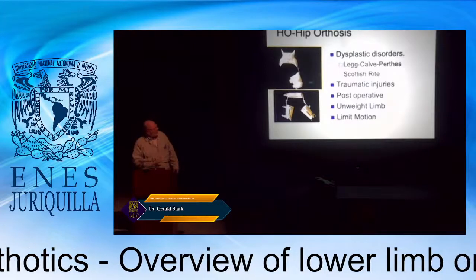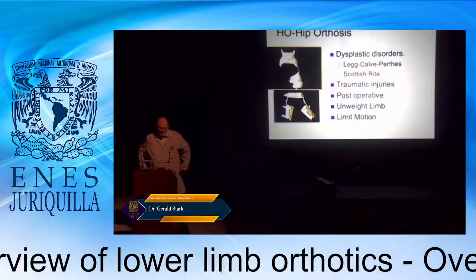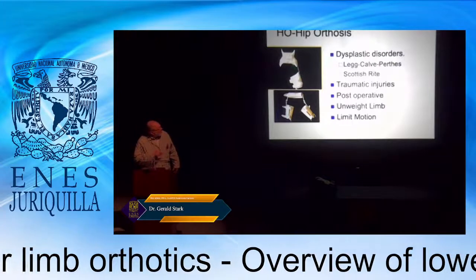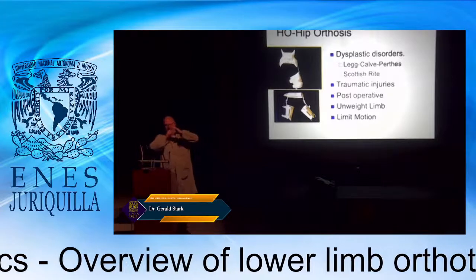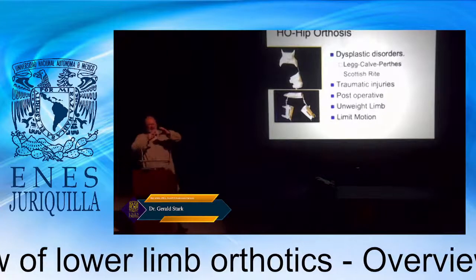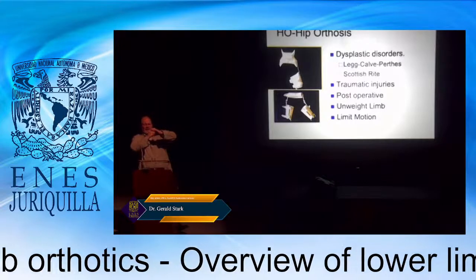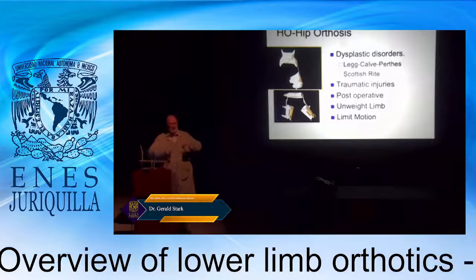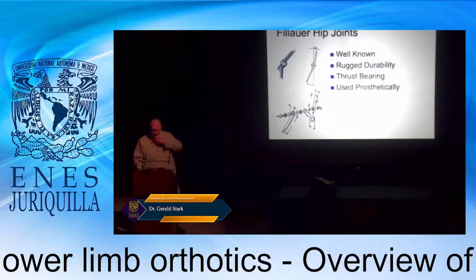And finally, we're coming to hip orthoses, and these are used for Legg-Calvé-Perthes or Scottish Rite or other types of injuries of the bone or deficiency of the bone to actually keep the leg in abduction. The acetabulum can be used like a jello mold if the head of your femur is injured in some way or has a flat spot. So even if this necroses, or due to a fracture, like Bo Jackson, if you keep the leg abducted, you can position the head of the femur so it will grow back into position the way it should and avoid any sort of permanent deformity.